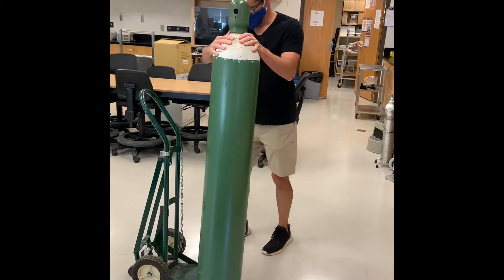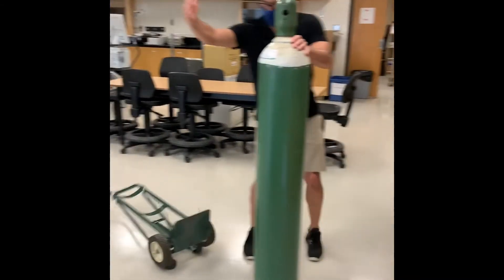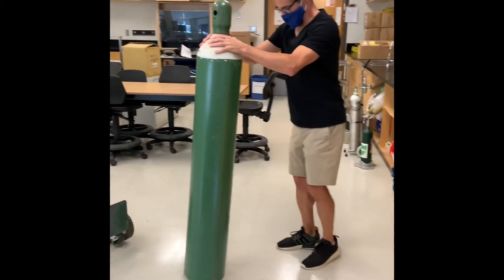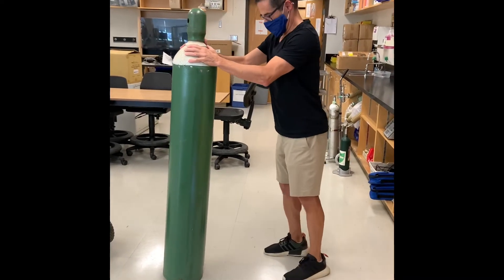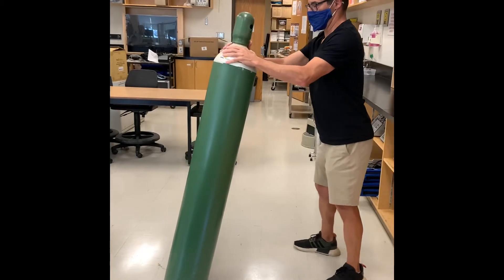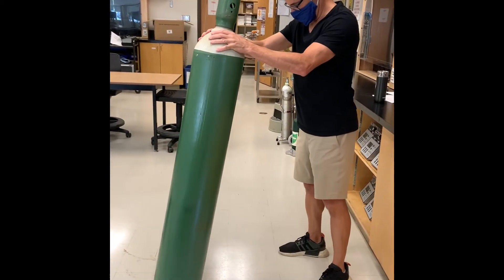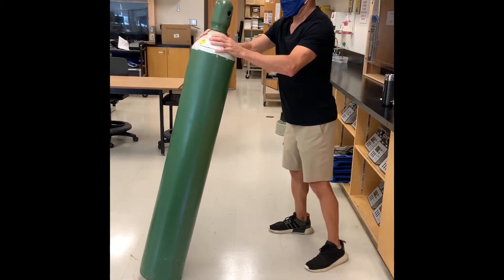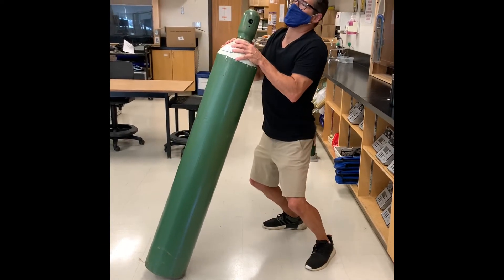Move it out of the truck. If you knock over the cart by accident, don't catch it — let the cart fall and hang on to the cylinder. You want to tip the cylinder slightly towards you so that you can move it on the edge of the cylinder. Don't let the cylinder fall too close to you, because if you pull it too close, it becomes heavier and harder to maneuver.